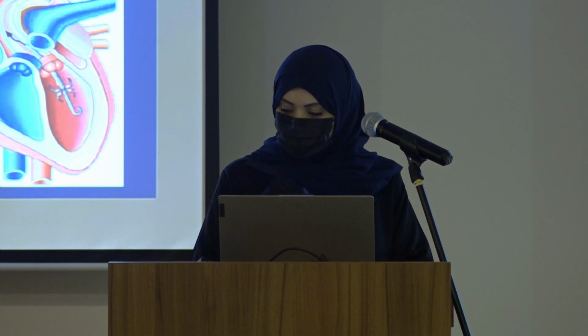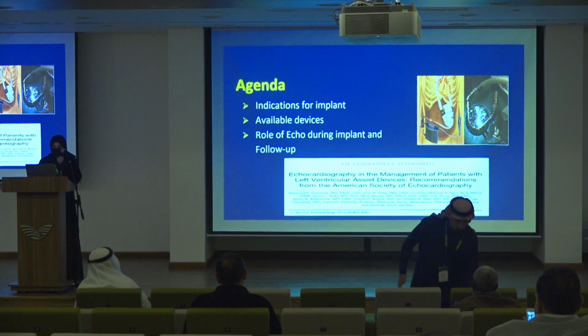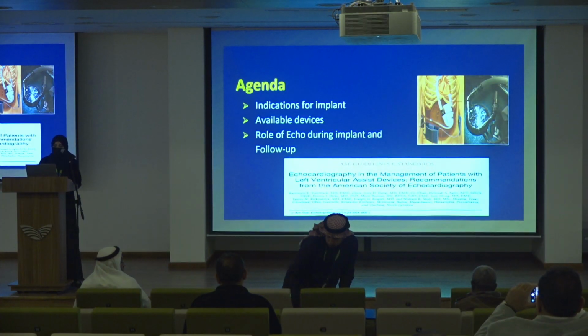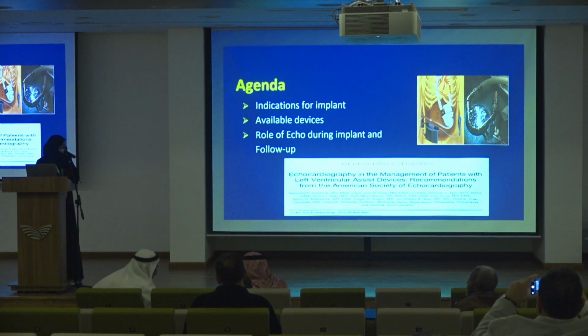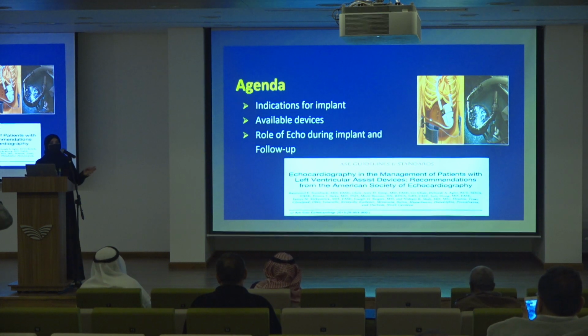Good morning to Rahim. Yes, I totally agree. The issue of point of care ultrasound is to give a quick qualitative assessment at the point of care, done by the attending physician, whatever his specialty. And then after stabilizing the patient, whenever he can be transferred, we can go for a detailed consultative echo. This detailed consultative echo should be done by a specialist in ultrasound and echo, who will give a full detailed report.